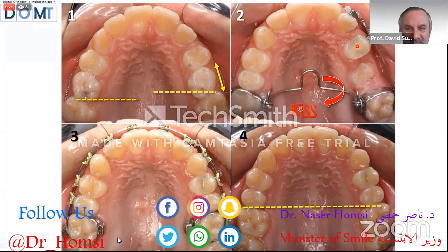Simple, because in this patient, what is the problem? The problem is the canine, but we need to move the molar backward. The first step is a palatal bar to control the first upper molars. Next step, remove this temporary molar and put a nitinol coil spring to distalize the premolar, to produce a forward movement of the lateral incisor and to correct the crossbite of this tooth.